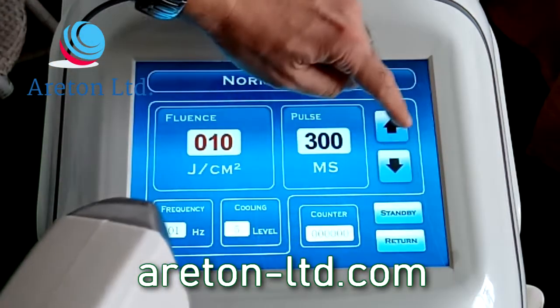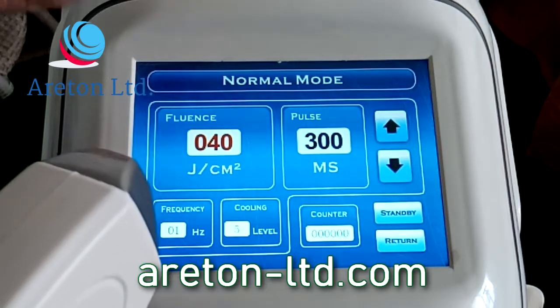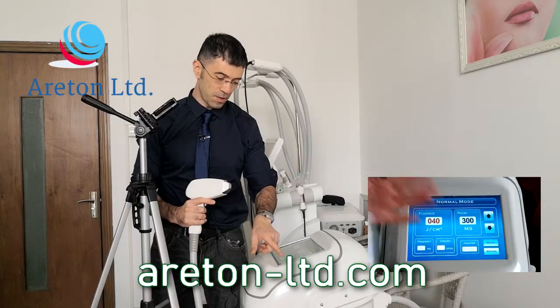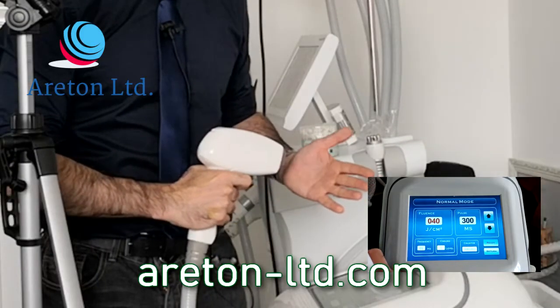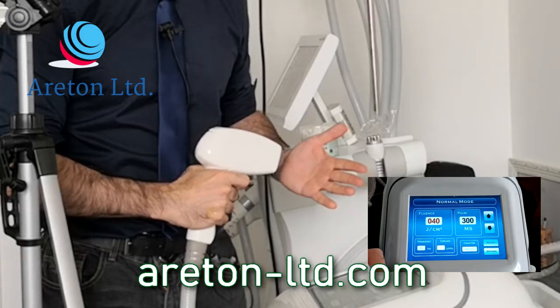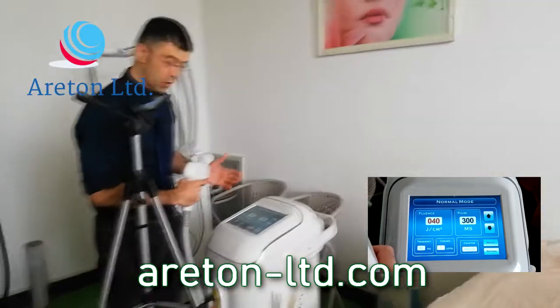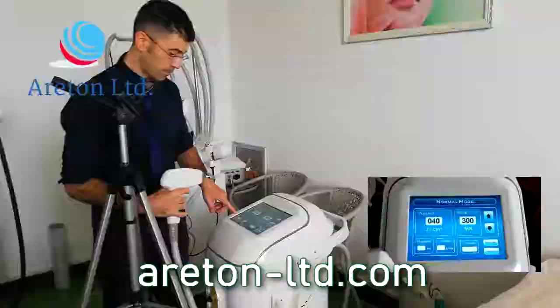And look, we can actually go up in power level as well. We're going to try it this way just to show you, but I'm not going to be crazy about it. I'm going to just fire it, and I can actually feel it. And the frequency is 1 hertz. At this distance I can feel it. If I go, I cannot dare go even closer because it's really powerful.